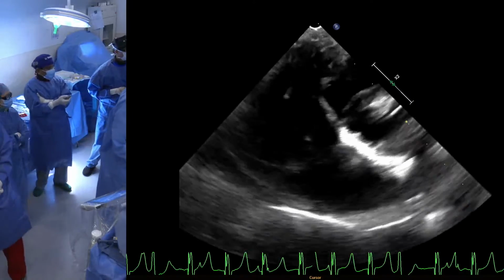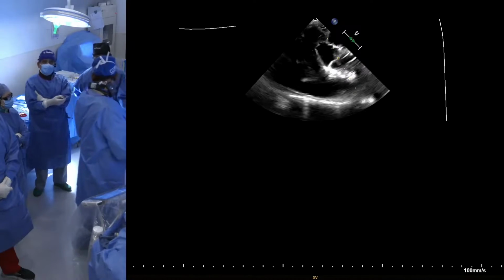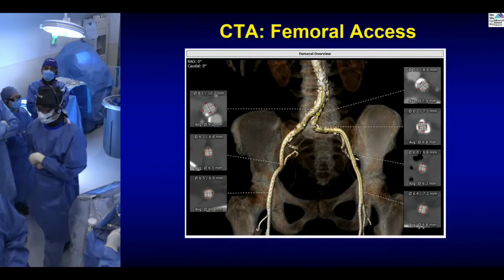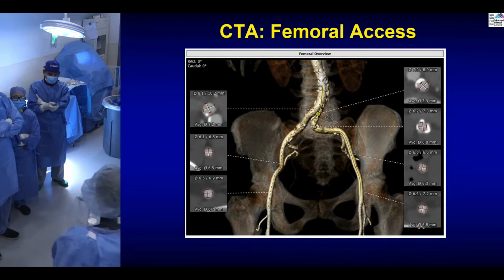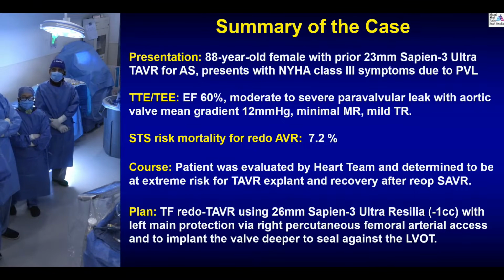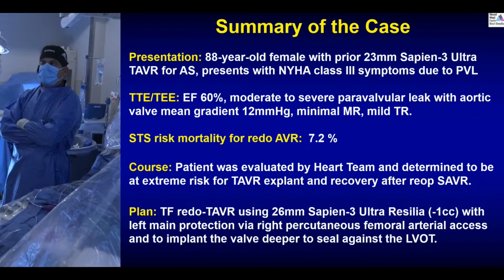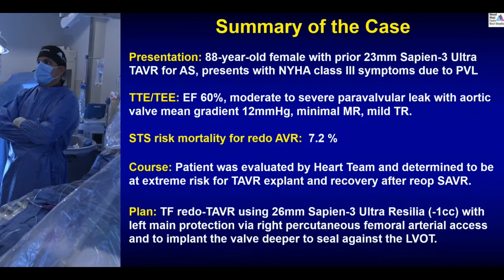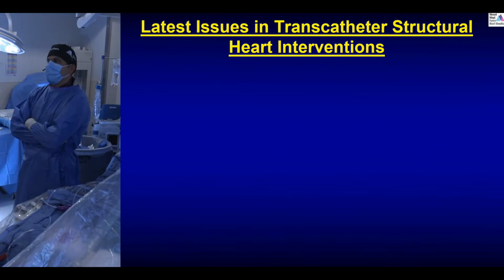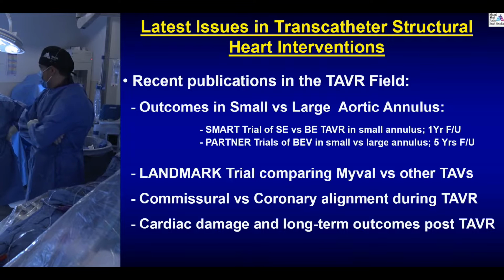Now, tell us a little more about your trial, which you're doing at present, and which cases are those? Right. So it's called Access Manta. You all know about the Manta closure system. It's a sandwich-based technique. So we designed this study for appropriate patients based on CT screening criteria that Gilbert, George Dangas, and myself wrote down. We are studying it in 10 sites in US and Canada. Out of 250, we have already enrolled 130 patients in the last 7 months. And so far looking good.